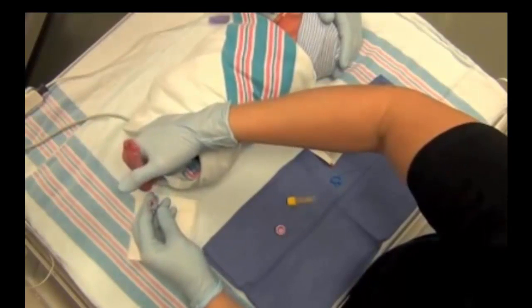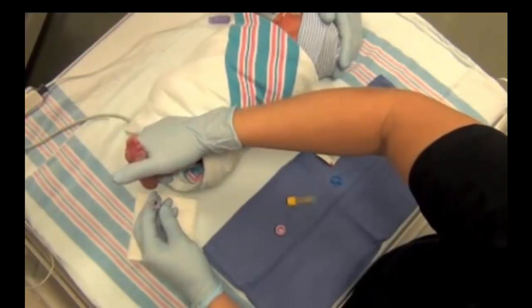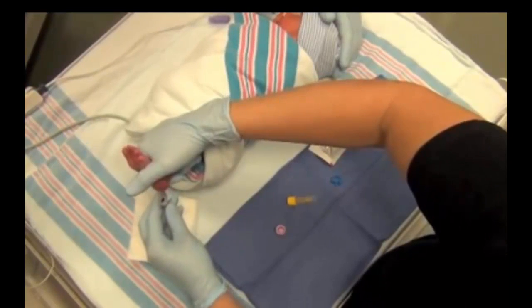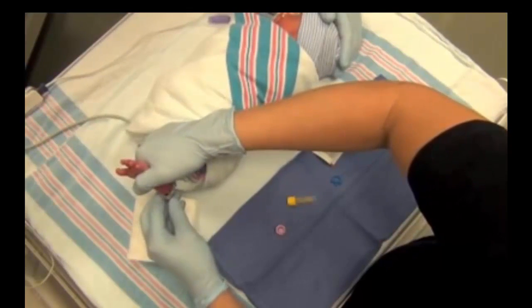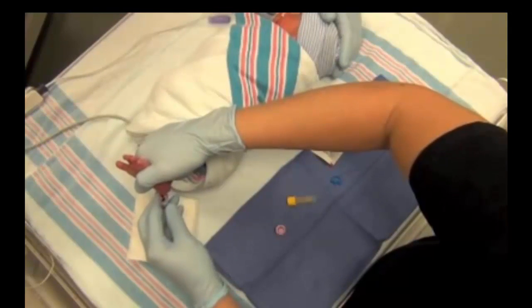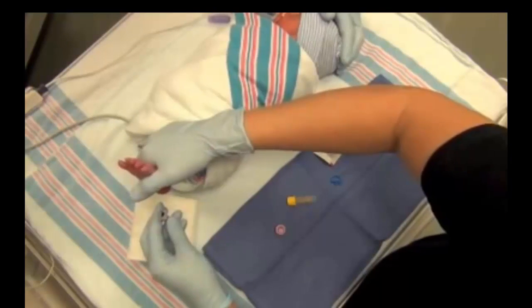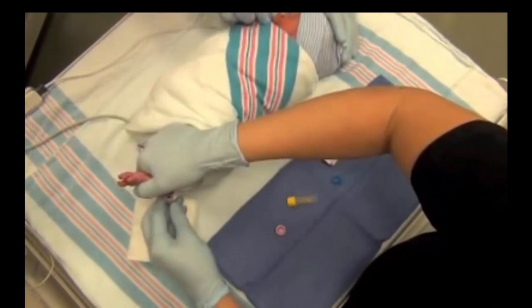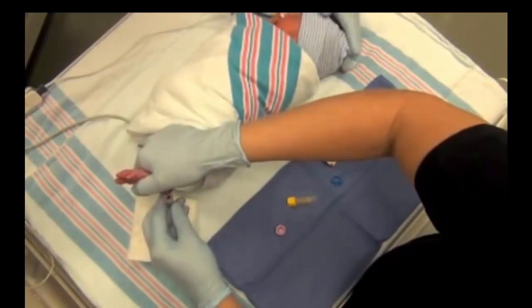Notice the hand positioning. The fingers are along the calf and the thumb stabilizes the ball of the foot. Pressure is applied to the calf in a direction towards the heel. Free-flowing blood is collected in a microtainer. When the blood flow ceases, calf pressure is released, the capillaries are allowed to refill, and the process is repeated.